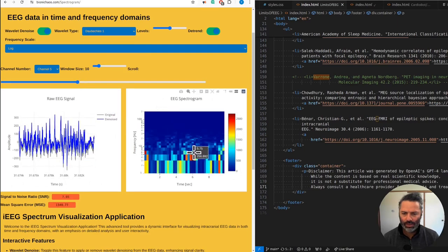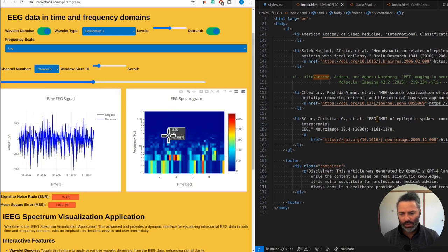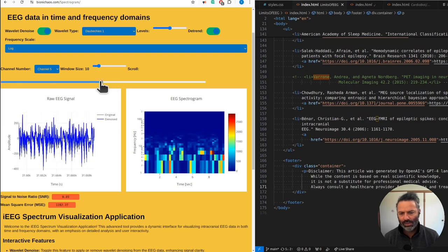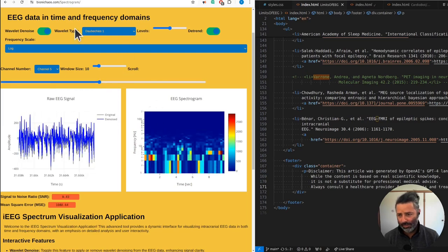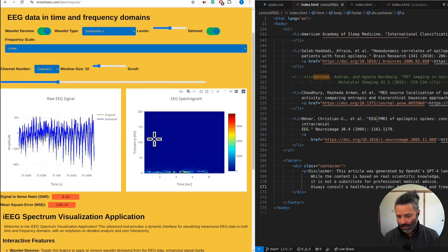It's funny how the spectrogram looks like it has a 3D component to it. But yeah, it's probably just because of the logarithmic scale. Yeah, you can turn it into linear scale, but then you don't see the details in the low frequency component.